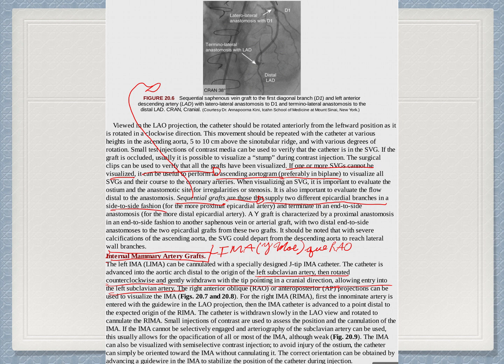The mnemonic for this is from Spanish, Costa Rican common vocabulary, as saying Lima or Imae, which means hey man. Que Rao, alluding to an ass. So hey man, what an ass. Lima que Rao. This meaning that you cannulate the left internal mammary artery in the RAO projection.